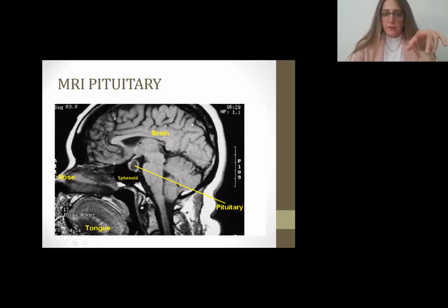Exactly, they will label, for example, see the area where it says brain, and then over here, and then over here, and then over here. So they will be labeling your brainstem, your cerebellum, and, for example, your pituitary. And then they will be telling you, okay, and your hypothalamus, for example, all of this entire area. And then they will tell you A, B, C, for example. And actually, that's good because you will be meeting a lot of this in your everyday life.